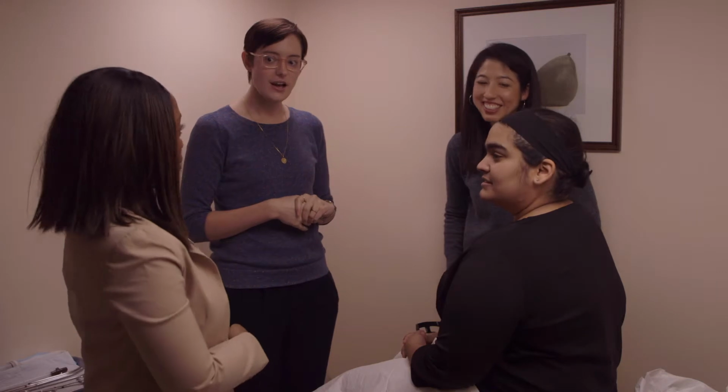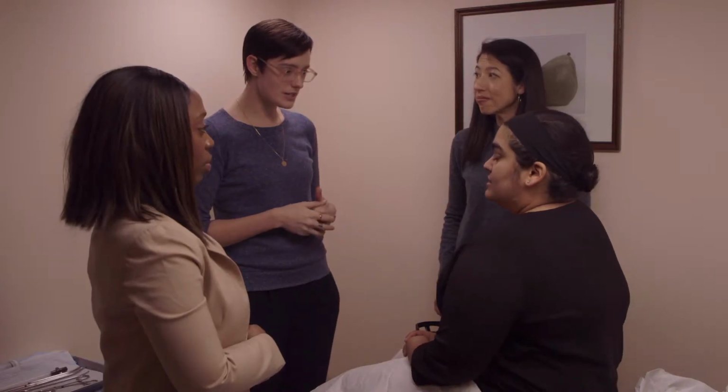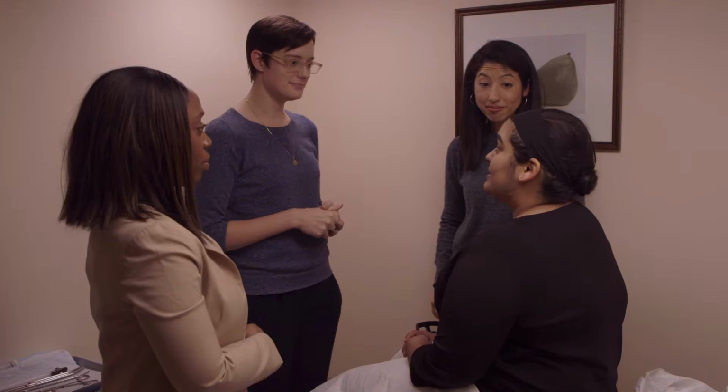So we've already gone over a lot of information, and you've taken your antibiotic and your ibuprofen. Do you have any other questions before we get started? No, I think I'm ready. Okay, great. We're going to wash our hands and then we'll get ready to start the procedure. Okay.